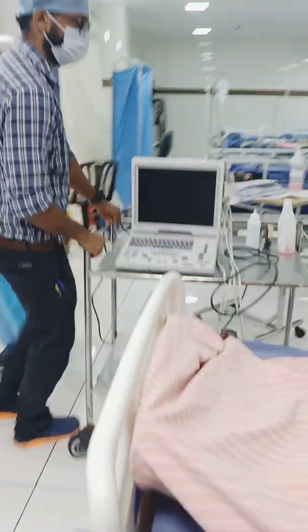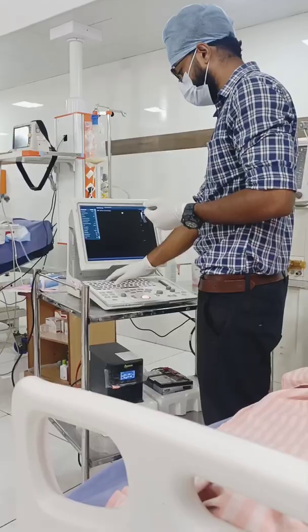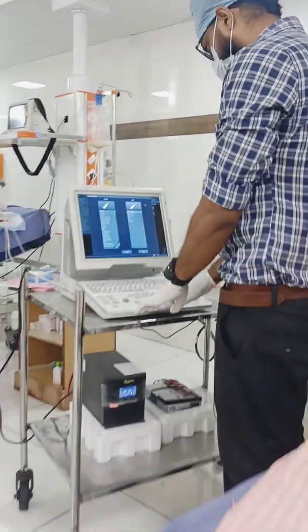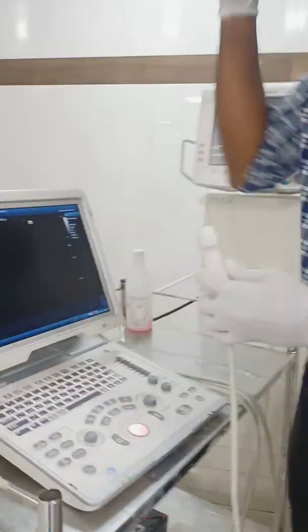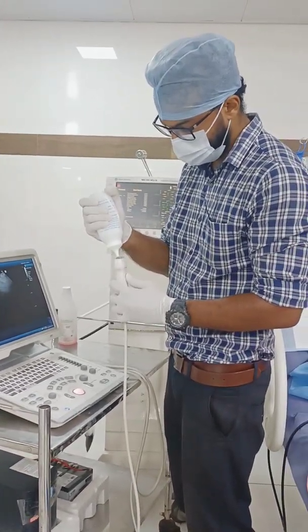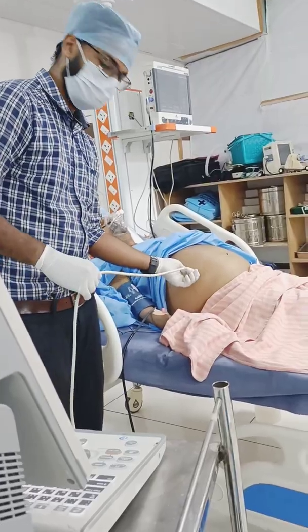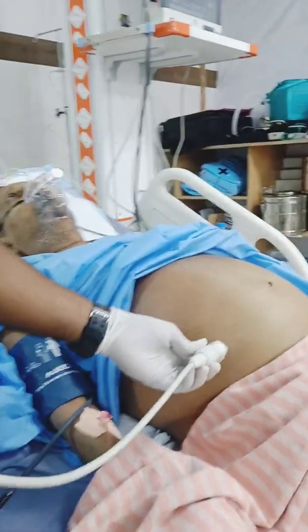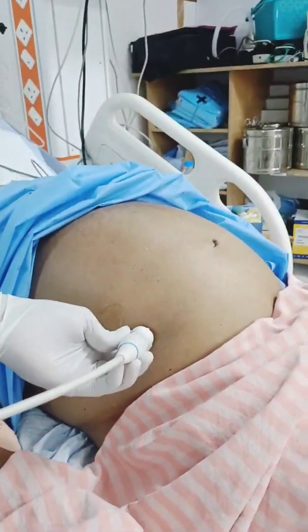Hello, I'm Dr. Jijo Martin. Today I'm going to be doing ascitic tapping, also called abdominal paracentesis. It is a procedure where we insert a needle into the peritoneal cavity to obtain ascitic fluid for diagnostic and therapeutic purposes.